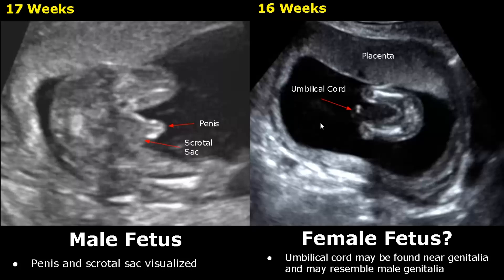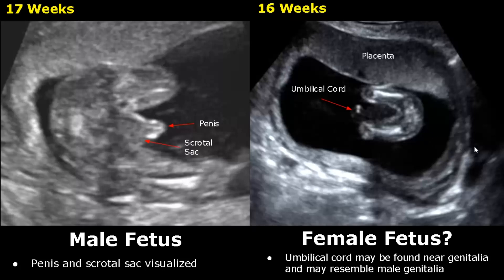Over here is a fetus of 16 weeks gestational age. We do not see the scrotal sac or the penis, but we can see the umbilical cord at this region. This cord can be mistaken for male genitalia, so always take care while scanning the perineum. It is better to wait before declaring the fetal gender.